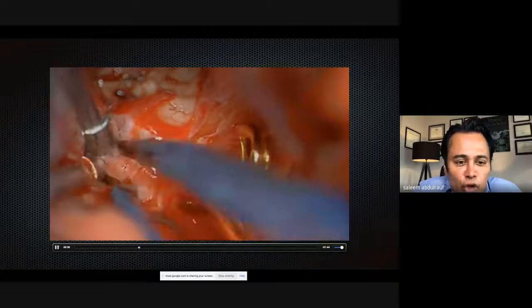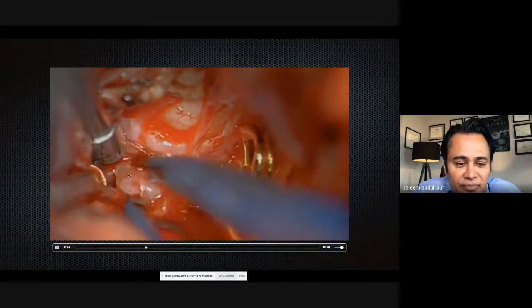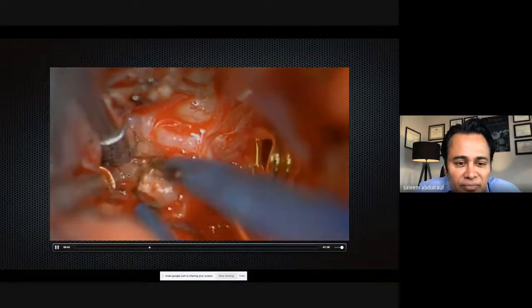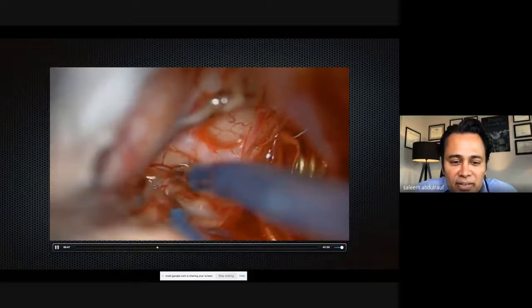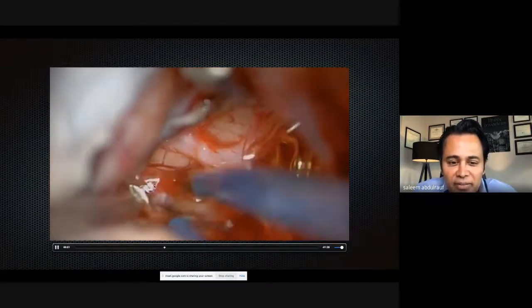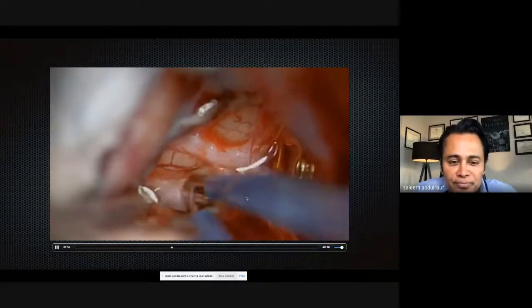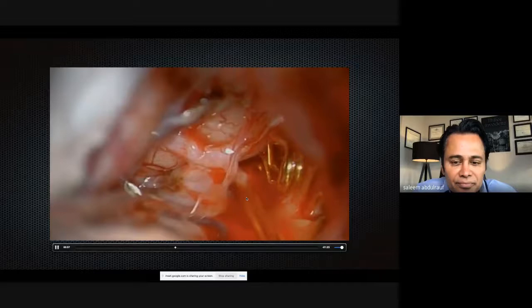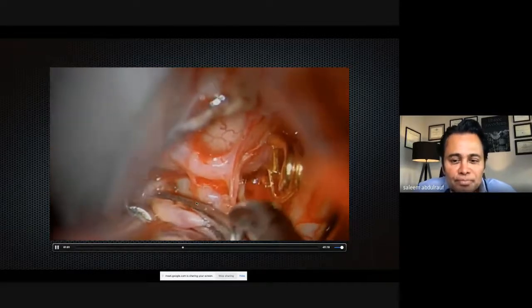You see, I control the whole of the aneurysm right there. Right there, that's the aneurysm, okay? That's a ruptured, intraoperative rupture of an aneurysm, okay? Right there. That's A2, A2. Now clipping the aneurysm, that's A2.